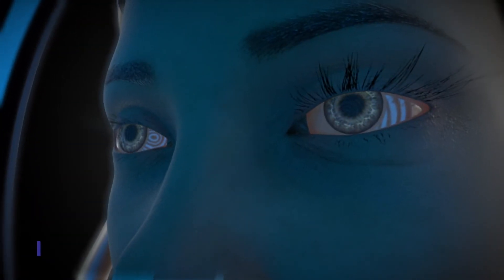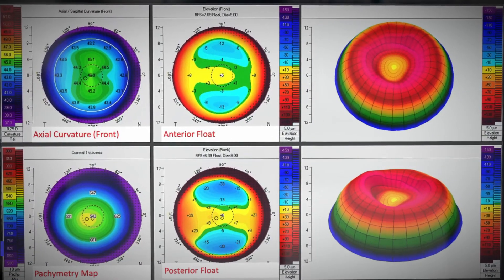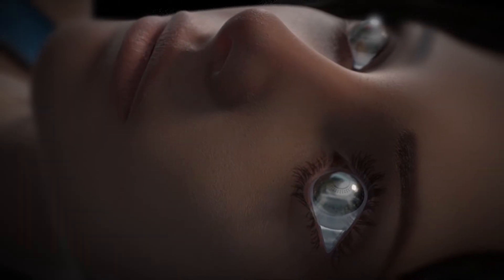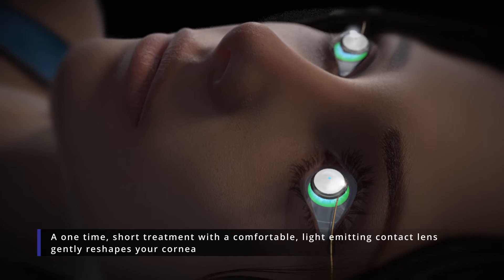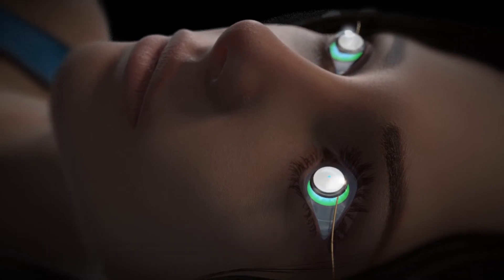The doctor will first measure your eye and build a computer model of it to help calculate exactly how to apply the light for your correction. She will then put a few drops of vitamin B2 in your eye and apply a specialized contact lens connected to a tiny fiber optic that will deliver a precise pattern of light to your cornea for a few minutes.